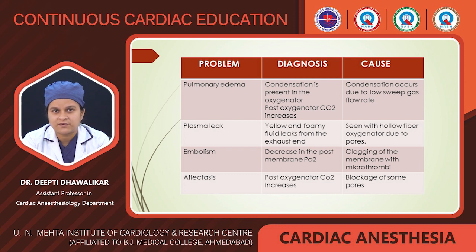So this table shows grossly all the problems which can be seen in the oxygenator. First is pulmonary edema. It can be diagnosed by condensation if it is present in the oxygenator, and post-oxygenator CO2 will increase. Cause of condensation is basically due to low sweep gas flow rate.